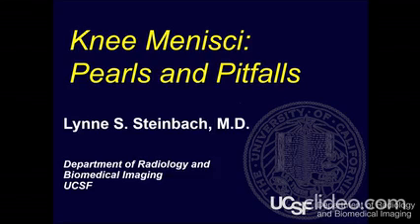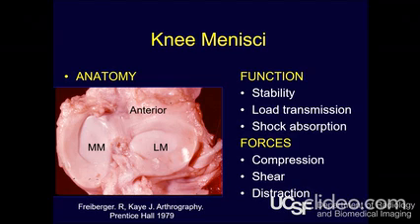Now I'm going to go off the shoulder and give you some information about the meniscus. I'll try to do some pearls, some updated information, especially about things like the roots of the meniscus, the ramp lesion, a lot of tears that we see with ACL tears, and some pitfalls as well.